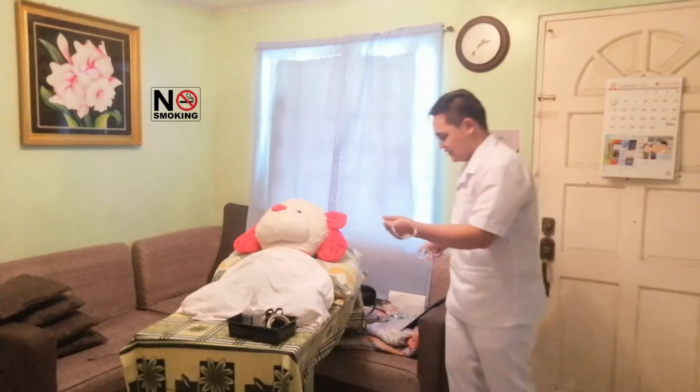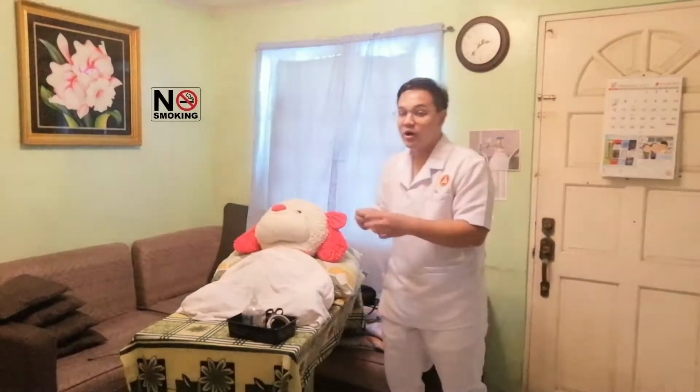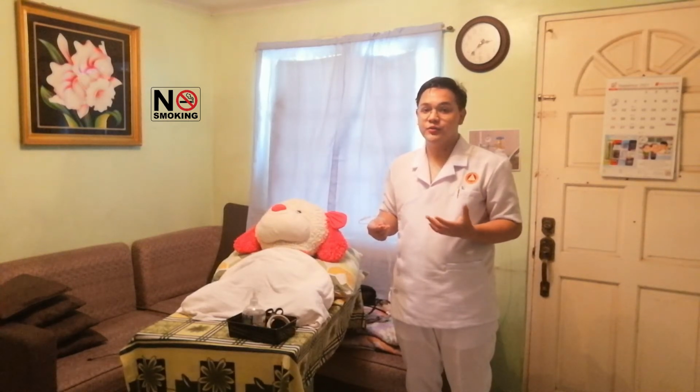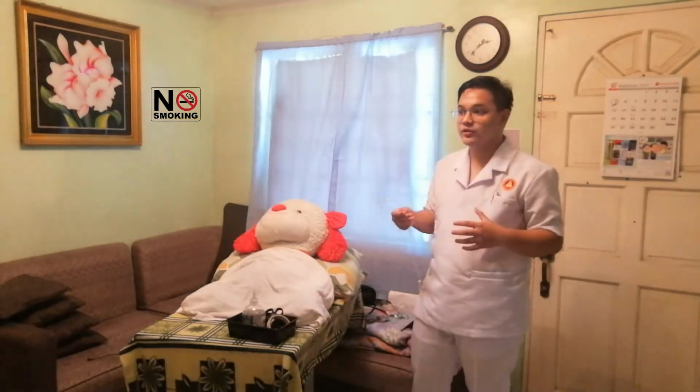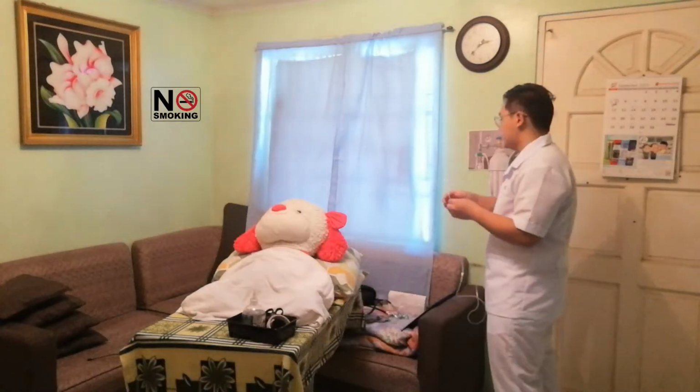Now that we have attached the oxygen tube to the tank, we will now move on to our next step, which is we will need to open or turn on the oxygen at a prescribed rate, and we need to ensure proper functioning. Okay, and to do that, we will need to first open or turn on the oxygen tank.